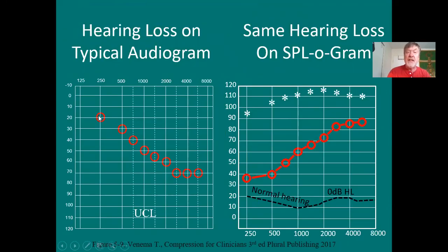And that's where we take the hearing loss measured in dBHL and we add in normal hearing in dBSPL. Remember that? Minimal audible pressure. The softest it takes to just barely hear all the different frequencies with one ear under a headphone in dBSPL, and you can see the variation in the decibels level.